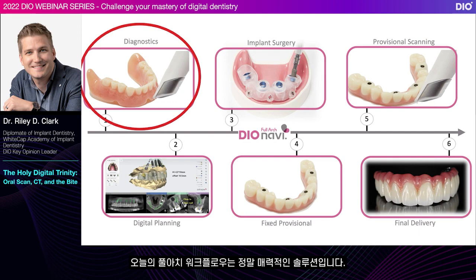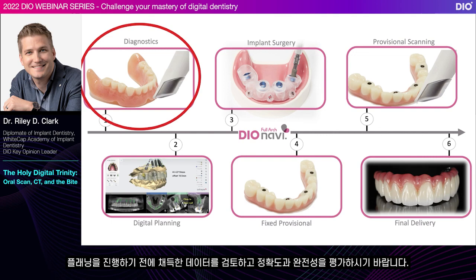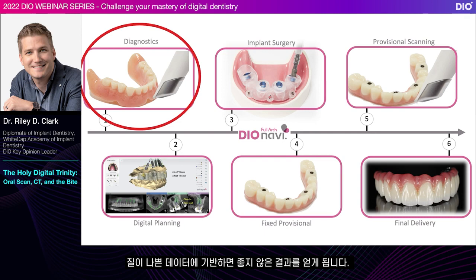So again, I'm going to start where I end. Our workflow today for full arch is really, really compelling. It is efficient, it is powerful, but it has to start with proper diagnostic data. So as you tackle your next cases, I invite you to be extra thoughtful with the intraoral scan you obtain, the CT you obtain, and the bite you obtain. I want you to look at it and evaluate it for accuracy and completeness before you move on with your digital planning, because if you're planning off of poor data, you will have poor outcomes.